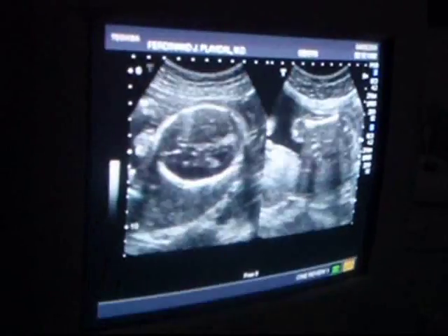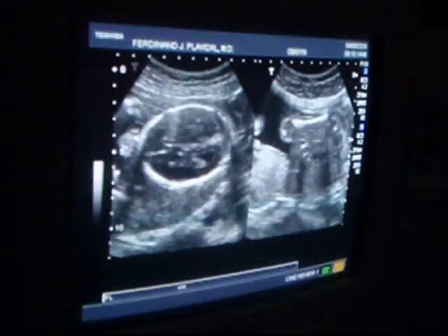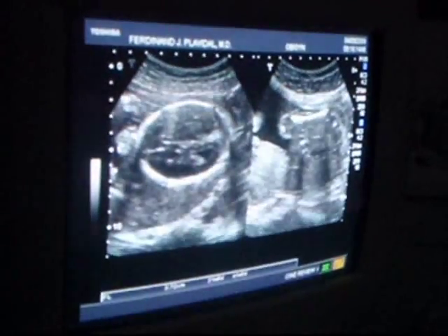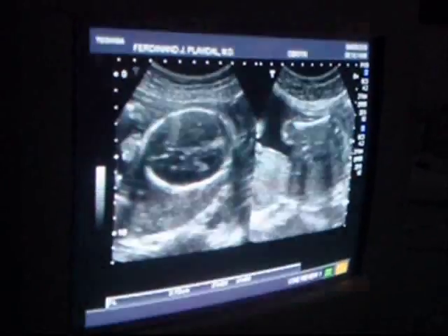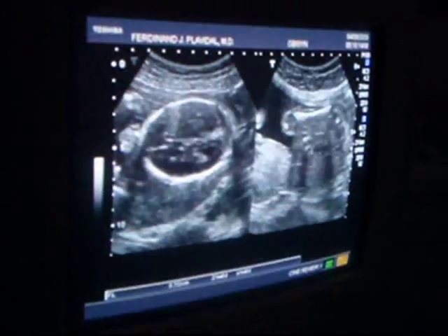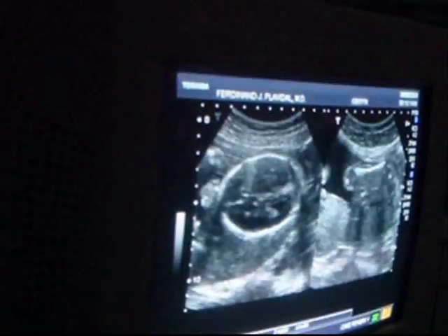And again, both babies are being very cooperative for me in terms of measurements. Very cooperative. I do appreciate it. Okay. We'll put that. We'll photo that. We'll put that on when they are the same size. It generally suggests good growth.